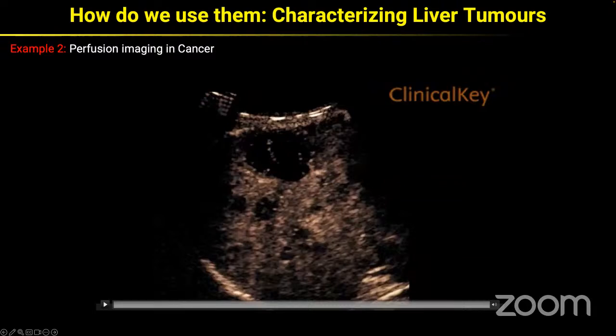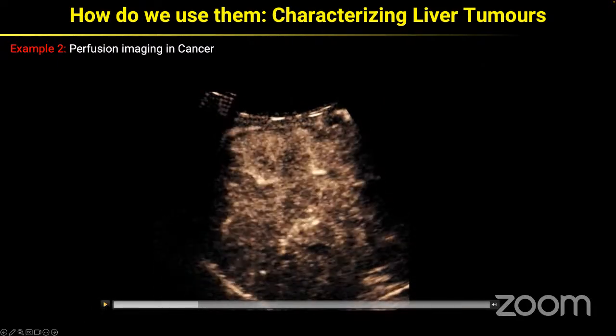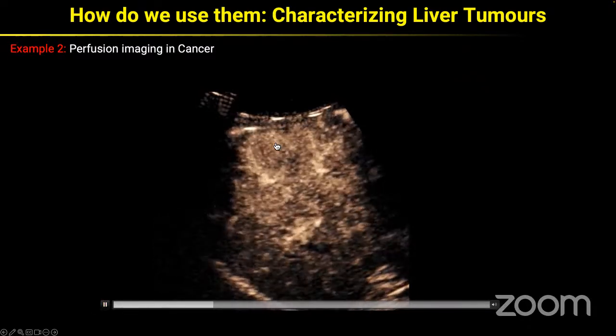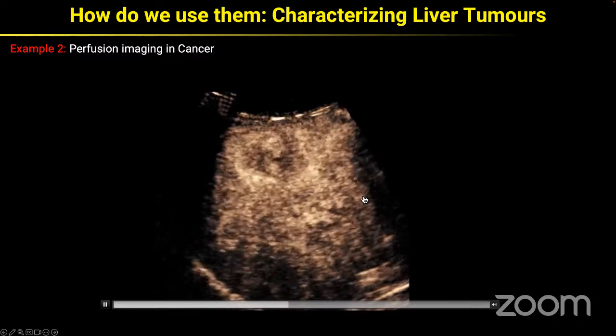And here's another example, this is a different metastatic cancer. And I want you to just keep an eye out up here on this region. Now, it seems like this is maybe a second dose because there's a little bit of background in this patient, but you can see when we inject the contrast, we get this. I'm just going to pause it right here. Right, you start to see this nice rim enhancement around the outside of it. And then we get filling of the vascular compartment in the tumor or in the liver.